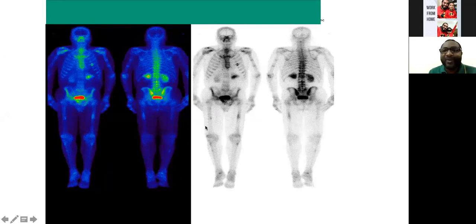Is there anyone who wants to attempt? Hello? Yes, Dr. Jawa. Hello. Anyone wants to? Is Dr. Sharif here, anyone who wants to make an attempt at describing this study? Dr. Amir Nabawi? Yes. Here you go, doctor.